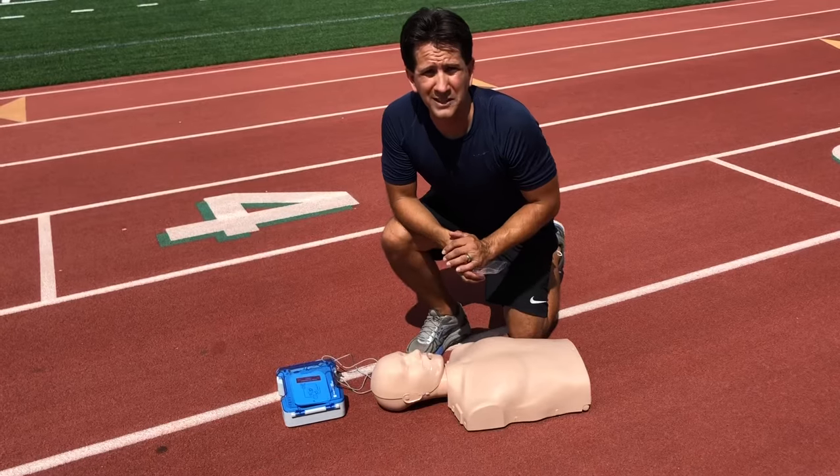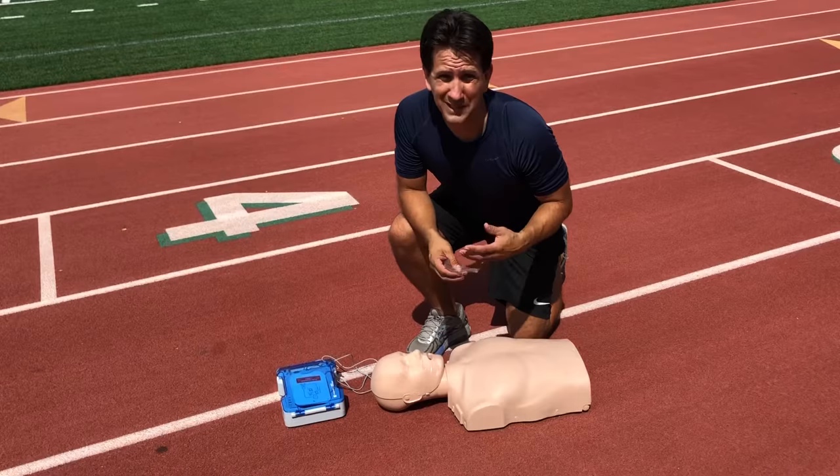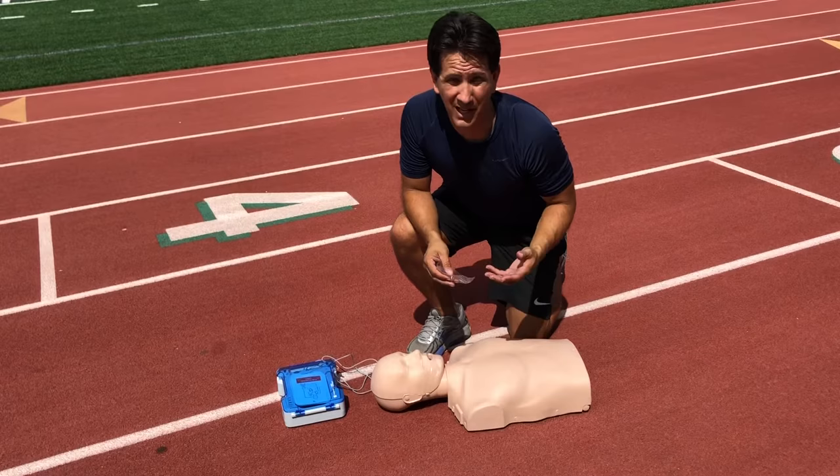The next part of this series is how to perform adult CPR when you have an AED available. AEDs are not always available, but sometimes they are, and when they are, they can be very effective for saving a life.